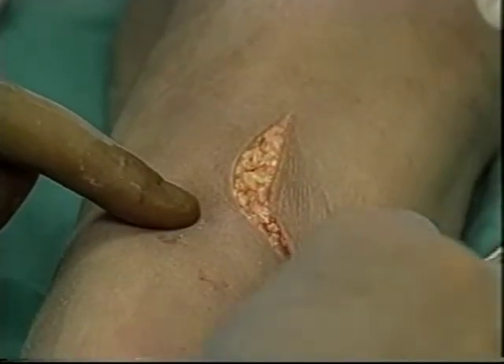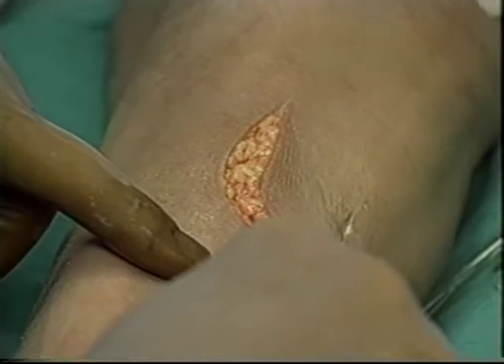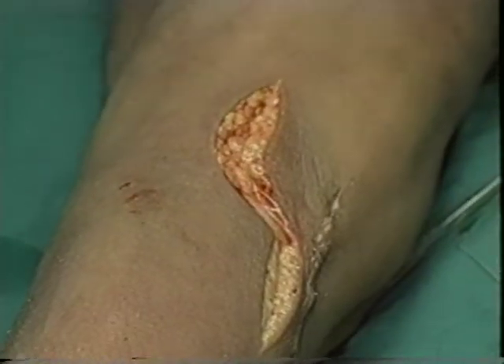With the patient in the prone position, a posterior incision is made crossing the popliteal space at angles so as not to cause contracture.